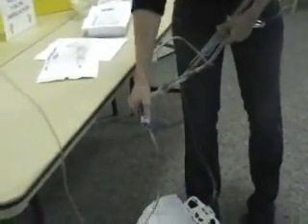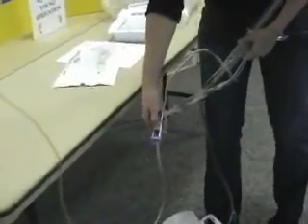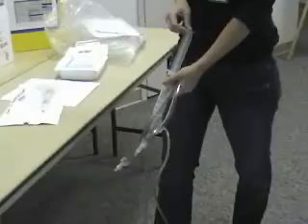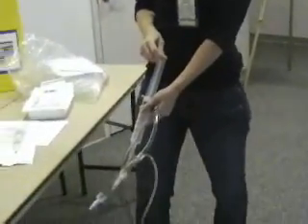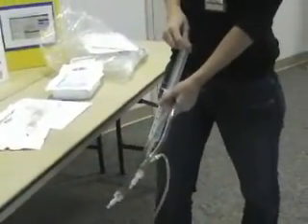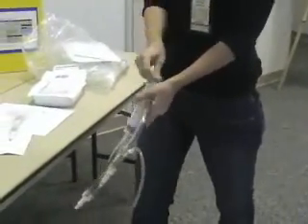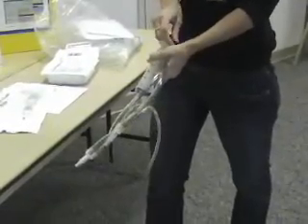A little bit is actually going into the bladder too at the same time. So you're going to clamp your irrigation, and then when you're done, you're going to actually start irrigating the bladder. Basically what this does, it creates a little whirl system into the bladder, and it gets all that stuff that's stuck to the bladder and the clots, and basically removes it. You have to be aggressive with it, because if you don't do it aggressively enough, you're not going to do your job efficiently. So you go back and forth really hard, and do that a good amount of times — it depends on how many clots and how bloody it is.